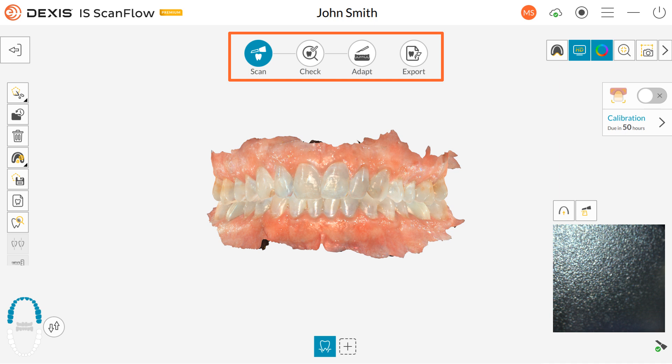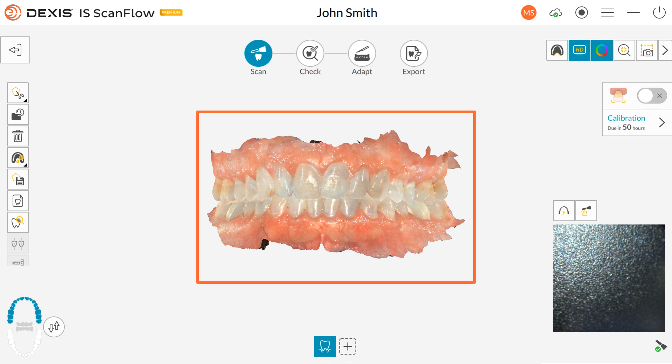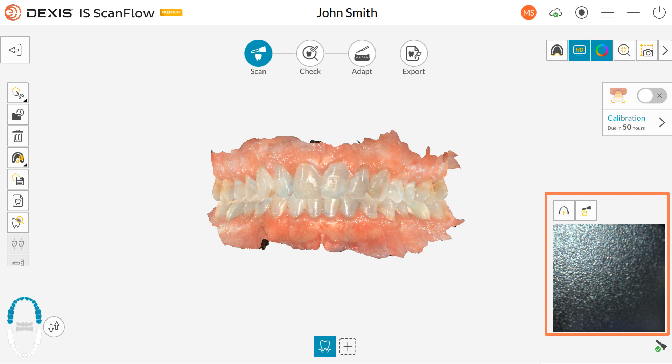The Acquisition Step icons indicate the current step in the acquisition process. The Imaging Toolbar enables you to select and manage 3D images. The Jaw and Bite Selector enables you to select upper or lower jaw, or the buccal bite registration. The Configure Scan Toolbar is used to select an acquisition mode and access specific tools for each mode. The 3D Model Display screen displays the 3D model created from the scan. The Video Preview screen displays live video while scanning the patient's teeth. The General Toolbar enables you to change how the 3D model is displayed. Click the Back icon to go back to the patient's information window. The Scanner icon displays the scanner status.